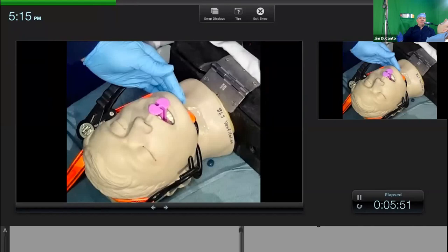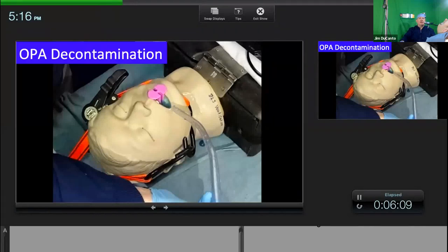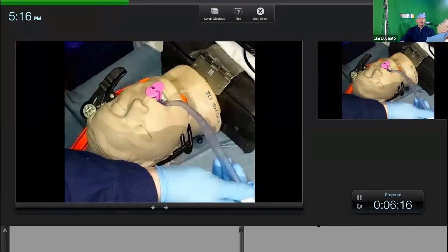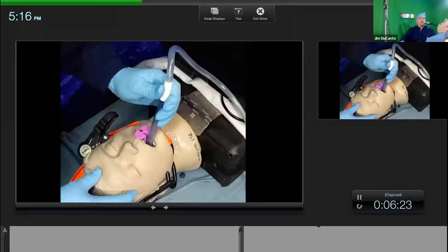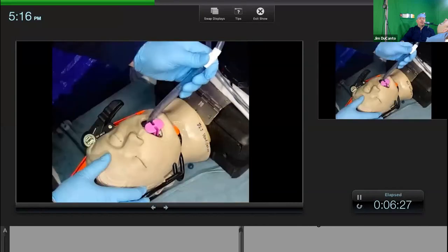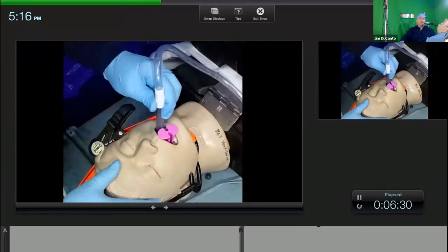I'm going to evacuate the oropharyngeal airway contaminants all the way to the back of the pharynx. And then I'm going to push and lift - I'm going to push the tongue into the floor of the mouth and distract the mandible inferiorly to ease the insertion of the oral airway. There we have that. Now during mask ventilation, if the mask ventilation becomes difficult, the procedure would be to pass the suction catheter along one side or both sides of the airway to decontaminate the hypopharynx.